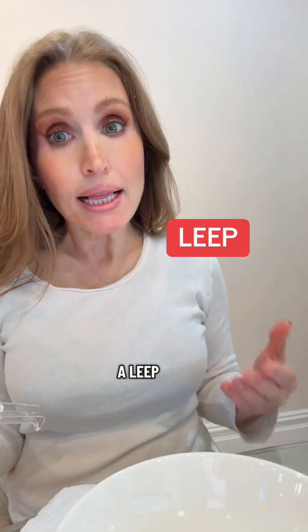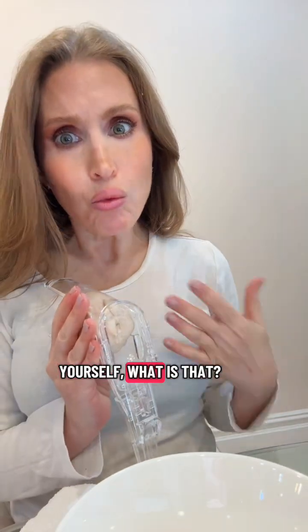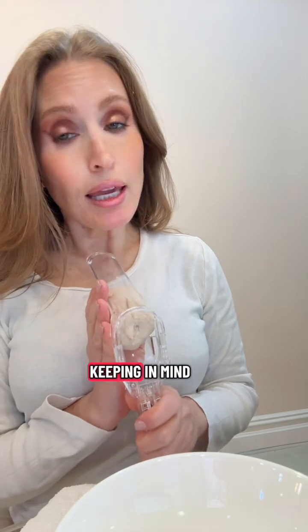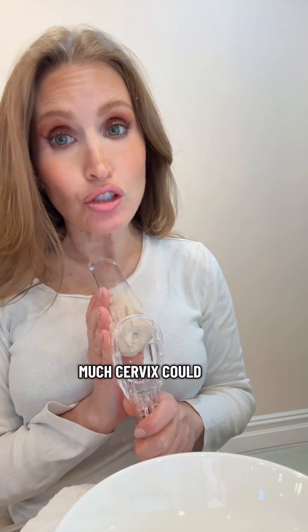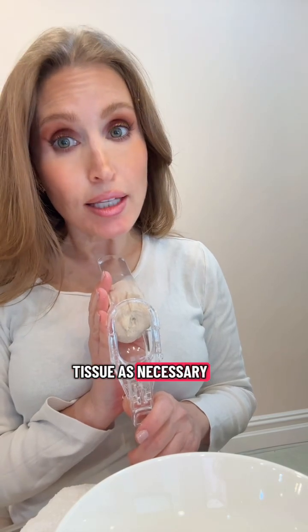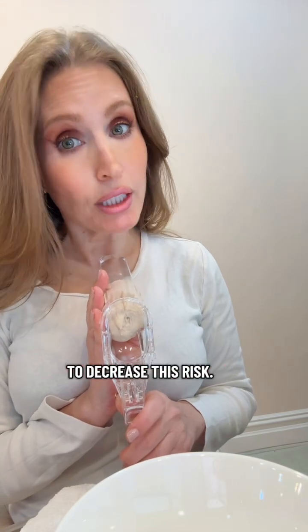That is called a LEEP, or a cold knife cone biopsy. You think to yourself, what is that? What are we gonna do? The reason why your doctor will do something like this is to preserve enough cervical tissue, keeping in mind you may plan in the future to have children, and taking too much cervix could increase your risk of preterm delivery. So your doctor's goal is to take as much tissue as necessary to remove all the abnormal while preserving enough of your cervix to decrease this risk.